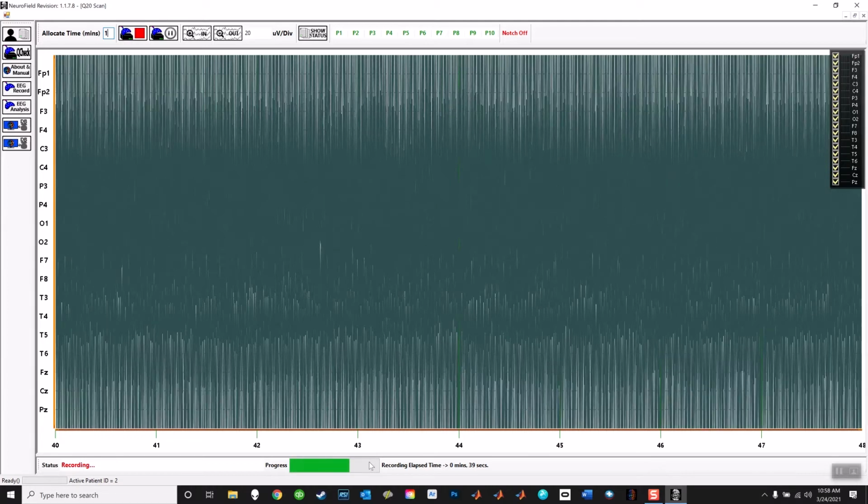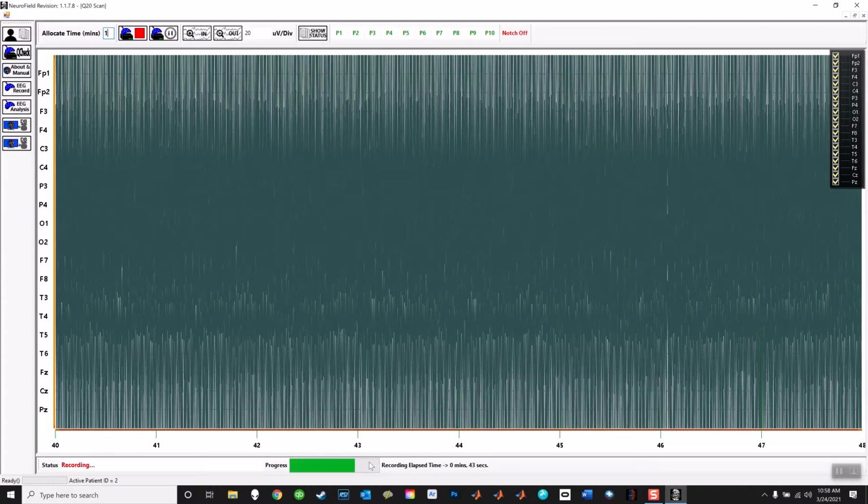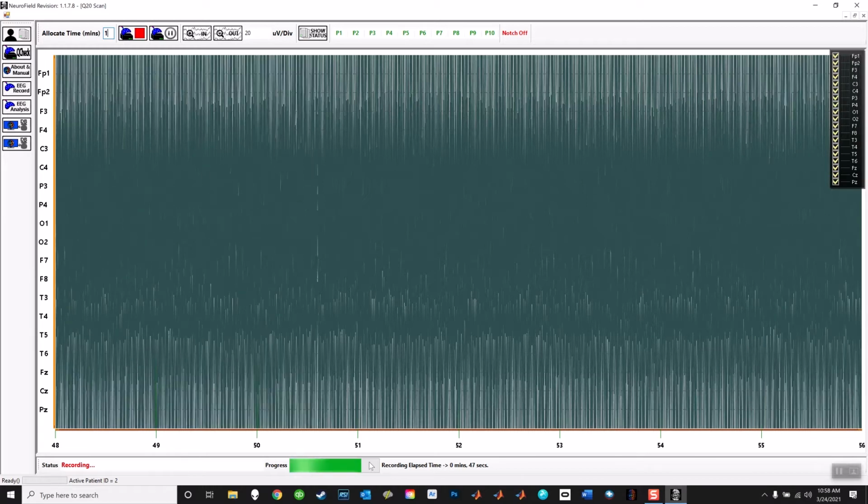I usually record my EEGs with eyes open first and eyes closed second. And it's up to you in terms of which order you choose.